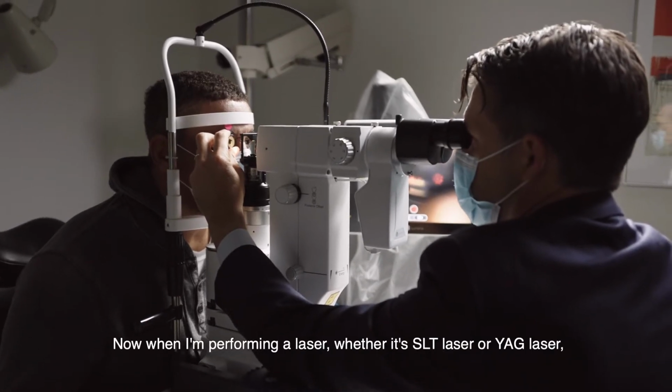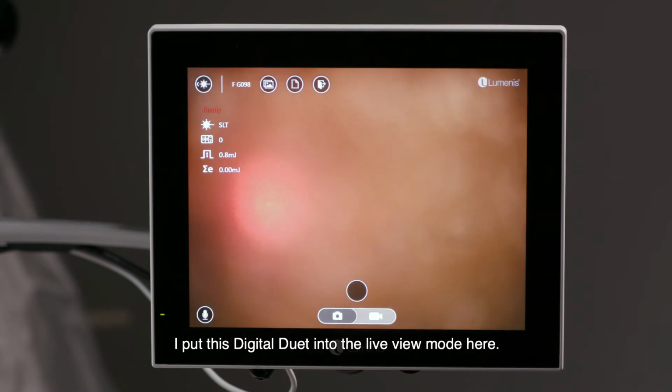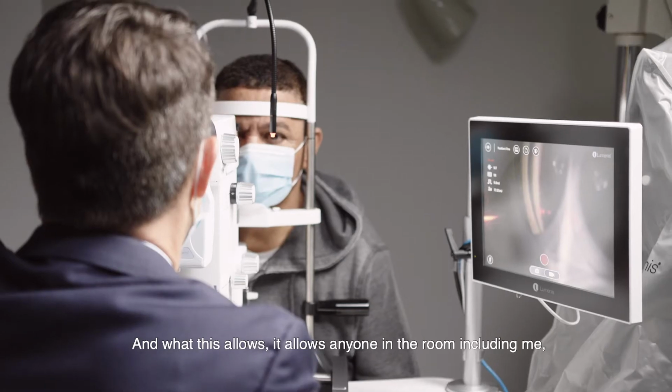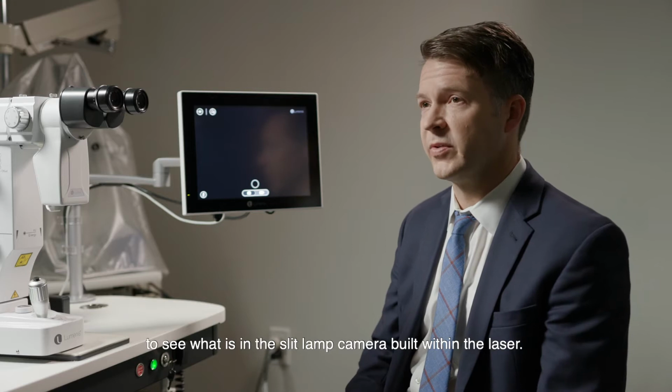Now, when I'm performing a laser, whether it's an SLT laser or a YAG laser, I put this Digital Duet into the live view mode here. And you'll notice I also have my settings up here. And this allows anyone in the room, including me, to see what is in the slit lamp camera built within the laser.